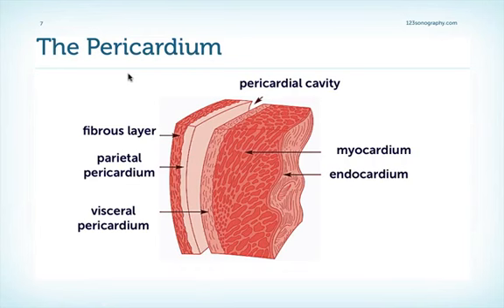Well, the pericardium consists of two layers. A thick, fairly fibrous layer, which is the so-called parietal pericardium, and a thinner, visceral part of the pericardium, which is attached to the epicardium. In between, there is a little gap, a gap which is filled with some fluid, usually not much more than 50 milliliters. Since the parietal pericardium is also very dense and thick, it is highly reflective, so we will easily see it with the help of echocardiography. This is not the case for the visceral pericardium.